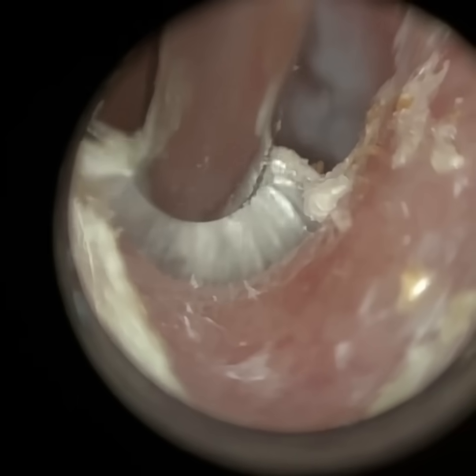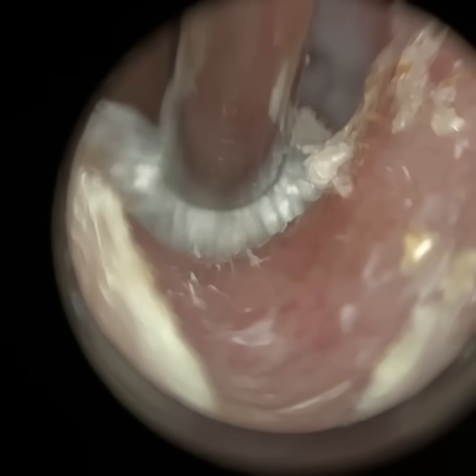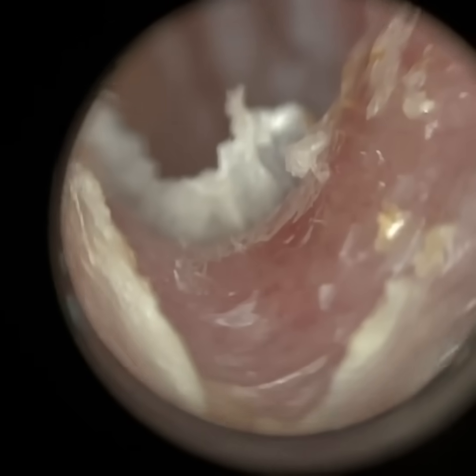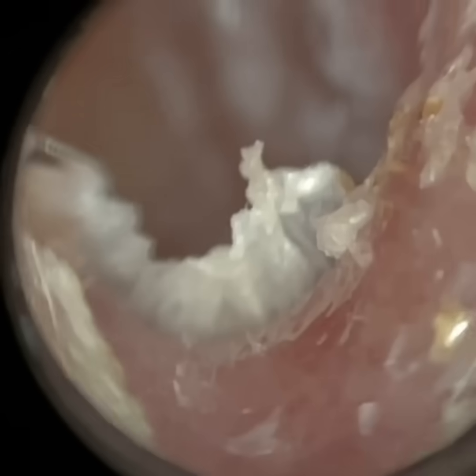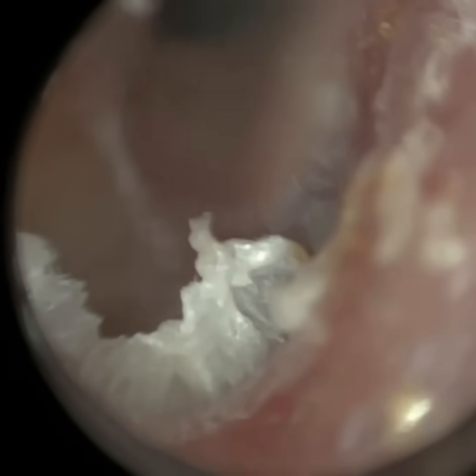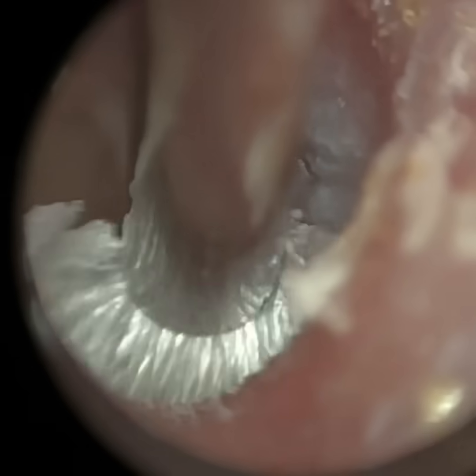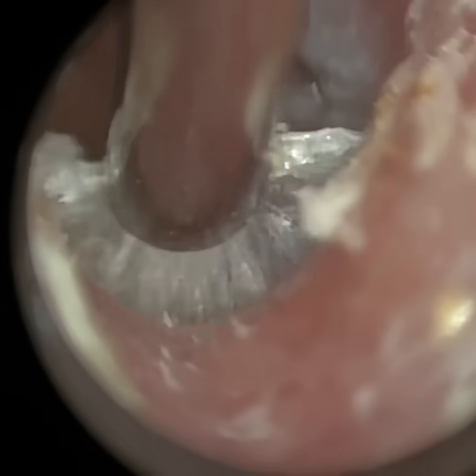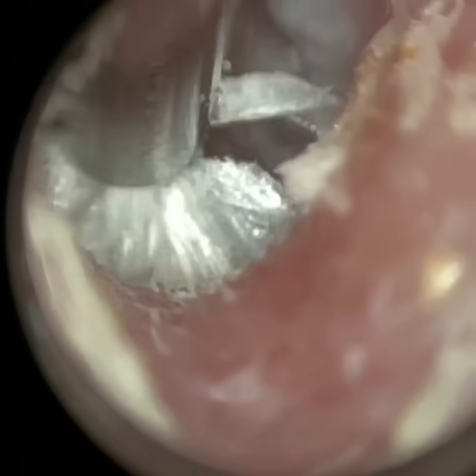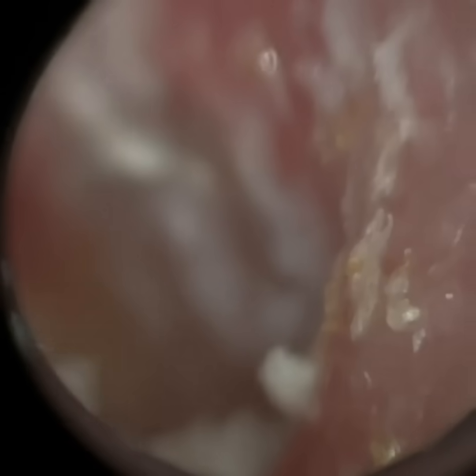There's just a bit of skin we're peeling away beyond the isthmus. I'm going to zoom in a little, but you don't want to over-zoom as the image can get a bit grainy. I think I can get a bit of this away, but we're also experiencing some clarinetting, so I've left a little bit behind. That's the fine end suction tip we're using. It was going to be quite hard to remove and we'd get more clarinetting — and this ear is very sensitive, even more so now because of the otitis externa.